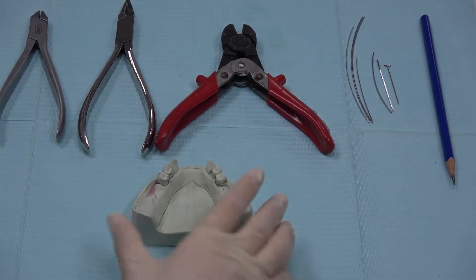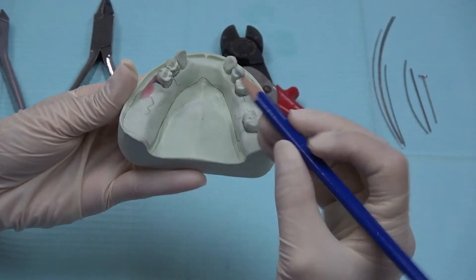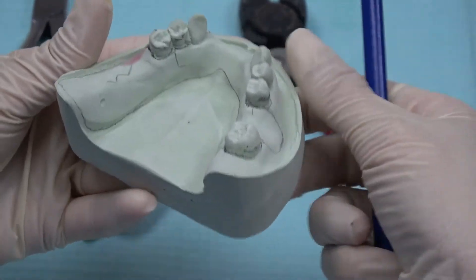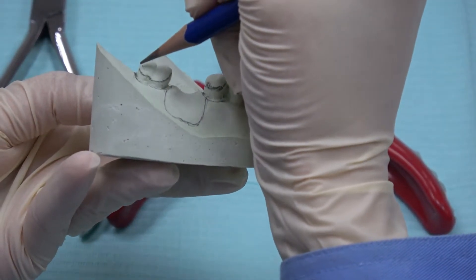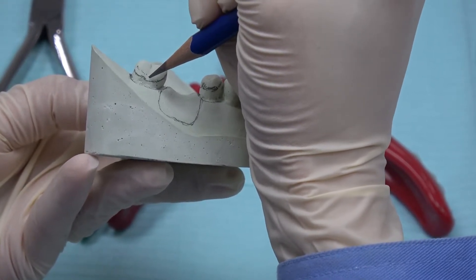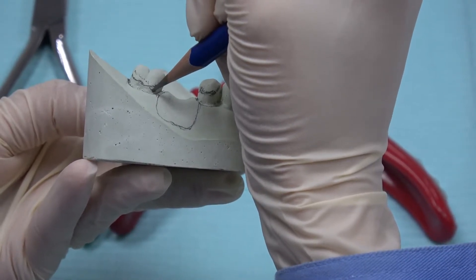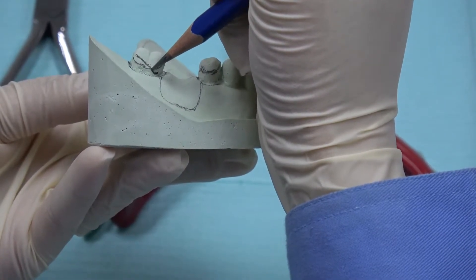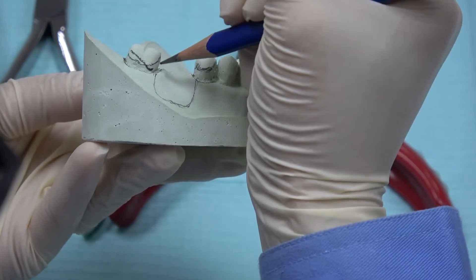Before we proceed to do the wire bending, first we have to draw the design of the denture on the cast. Next, you have to draw the design of the components on the teeth. Make sure the components that you are bending are below the undercut to have retention. When we are doing wire bending, it should follow the contour of the teeth.